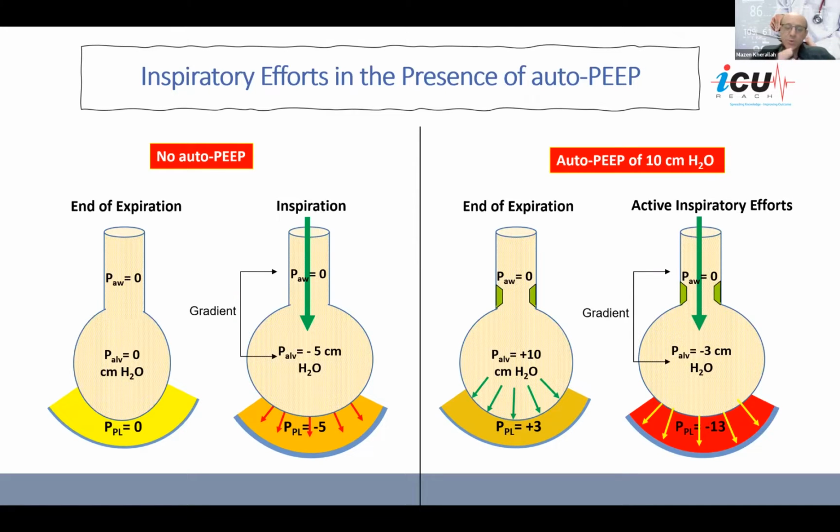Try to utilize all the inspiratory time towards the inspiratory flow time. You don't want to keep any plateau. Maximize the inspiratory flow time and leave everything for expiration. So if you're able to extend the expiration to the level that you get rid of the auto-PEEP, that would be great. However, what if you started compromising the ventilation and you cannot extend the expiratory time more? Is there a way you can help the patient?